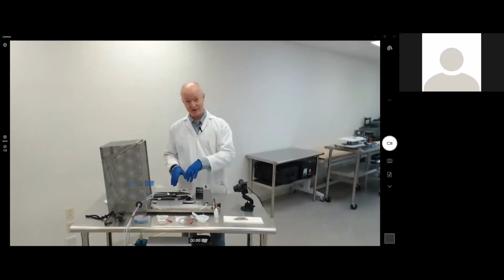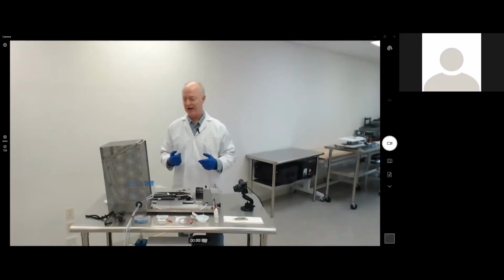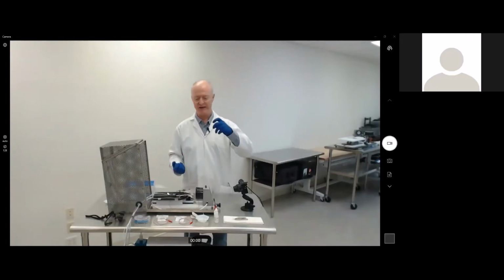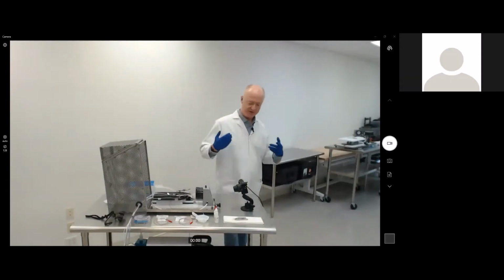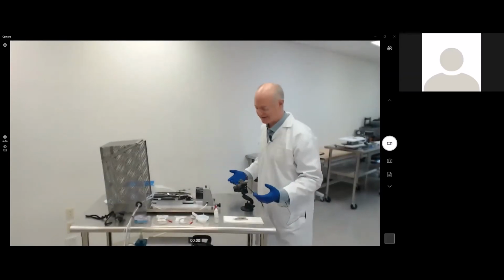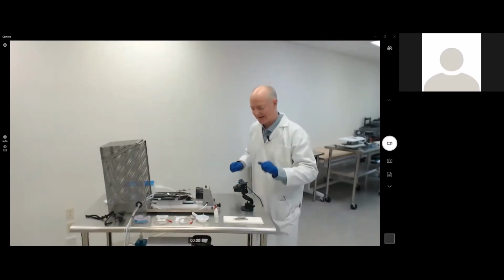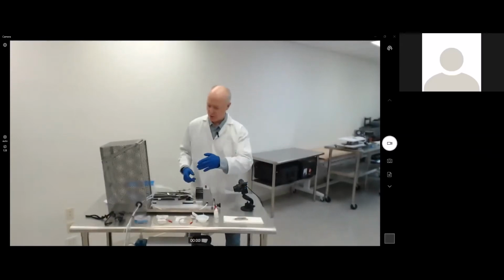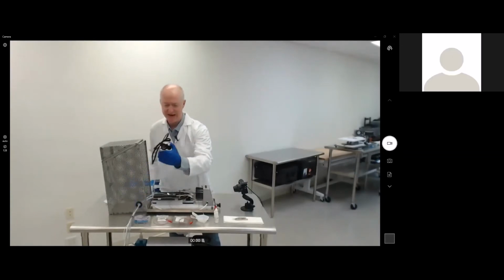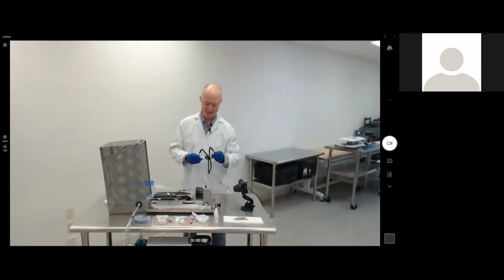We'll conduct an ERG on a mouse here to show the setup, but later we will actually wheel the cart in and we'll conduct a second ERG in the dark. So you can see the environmental changes and the effect they have on doing the ERGs. But since we're working in the dark, we want to keep everything in a dim red room, and we have everything laid out so we can get the ERGs done efficiently. So we have my loupes because at my age, I need to be able to see more closely than my eyes will allow me to.